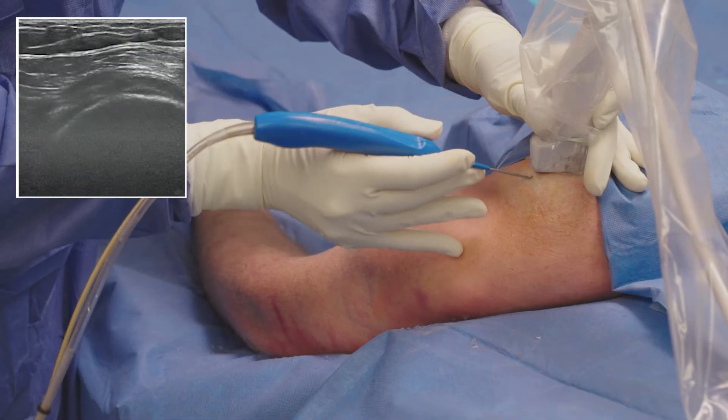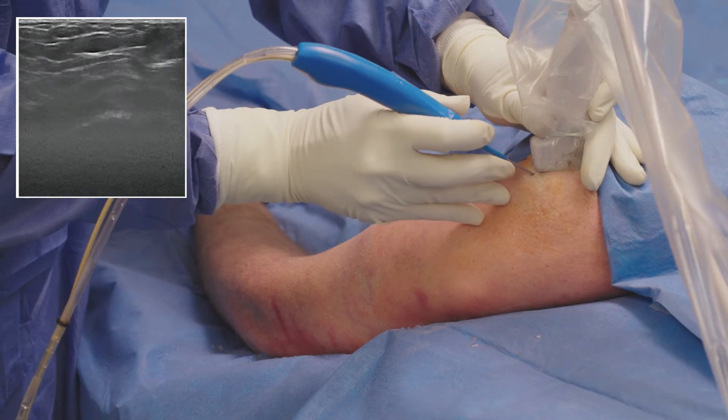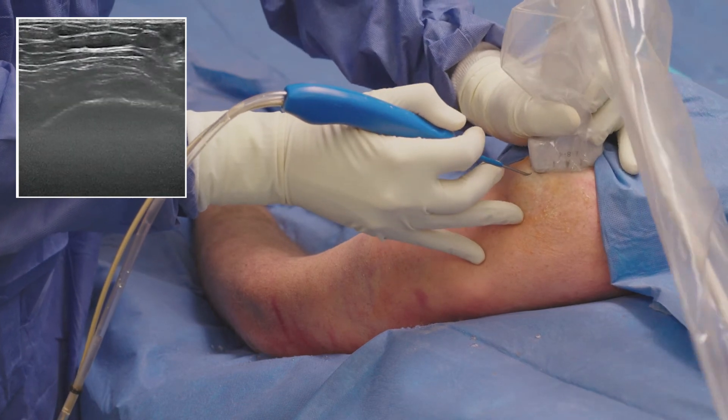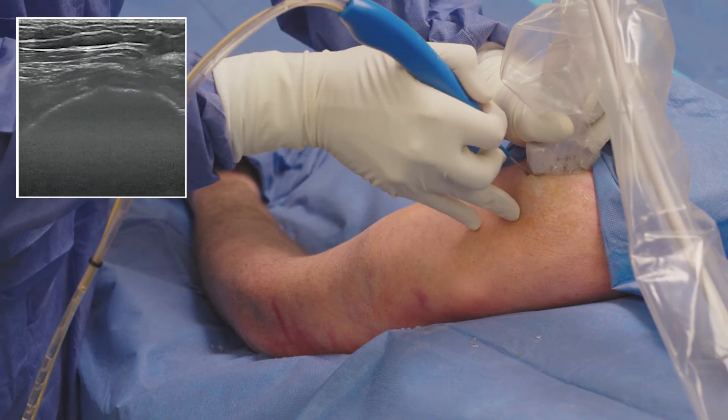Once I have created a pathway for the TenJet device, I guide the TenJet needle toward the pathology while visualizing it under ultrasound. You can see on the ultrasound the TenJet device is going towards the diseased pathology within the supraspinatus tendon.